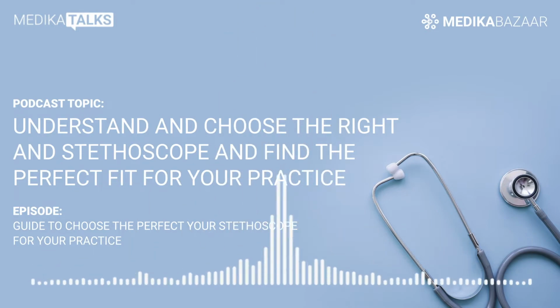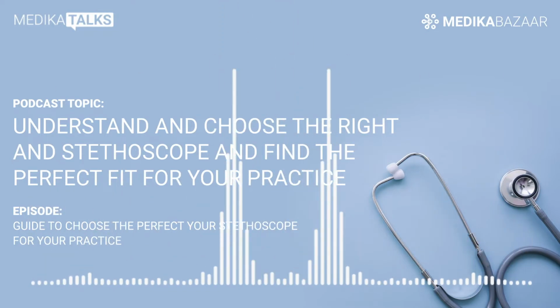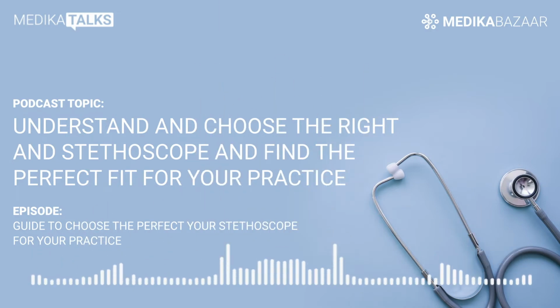Some pediatric stethoscopes are available in different colors and some even have adjustable animal figures on the head. Pulmonologists and cardiologists usually prefer an electronic stethoscope to benefit from high precision acoustics and have a view of pulmonary or cardiac sound on their screens. Electronic stethoscopes are more expensive but allow healthcare professionals to hear high and low frequencies in order to detect possible pulmonary or cardiac irregularities.